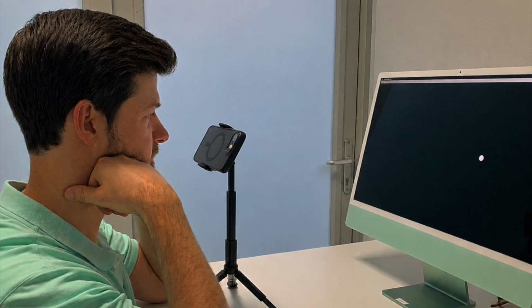It also looks from the photo like the height might not quite be right, that it might be slightly obstructing the view of the dot on the screen, but hopefully you get the idea from this in any case. I always instruct the patient to rest their elbows on the desk and put their fists against their face to reduce head movement.